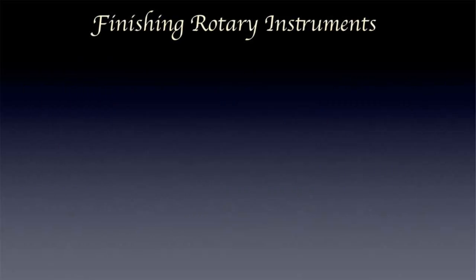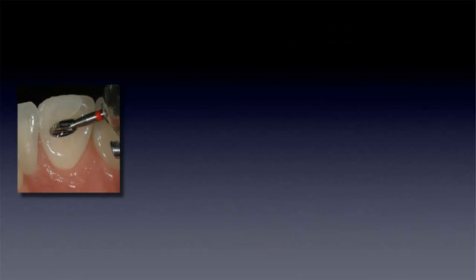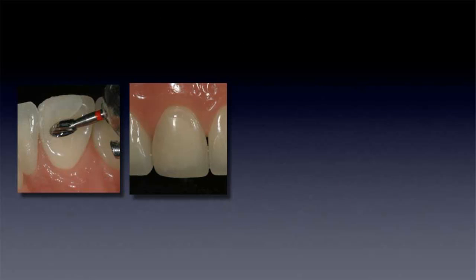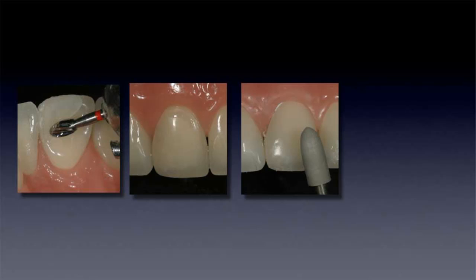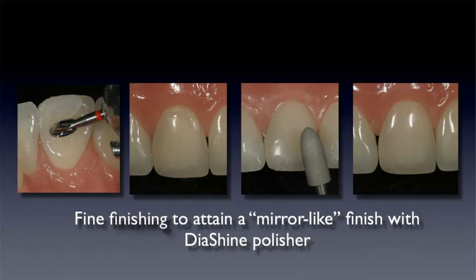As a troubleshooting thing, one problem I've come to find is when you are dealing with little voids. How many of you have this problem? Yeah, we all have this problem, right? It usually happens when you put your last layer on and you cure it, and as you're curing it, you can see a bubble in there. And you're thinking, oh, what am I going to do? Do I have to take this whole thing off? One of the things I do is use smart technology to help decrease your stress in repairing or filling in the voids.